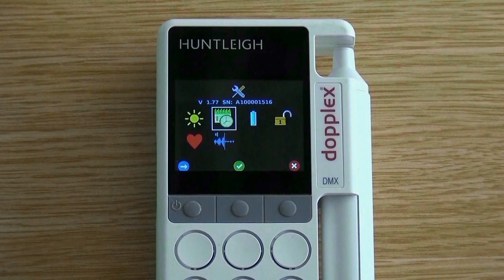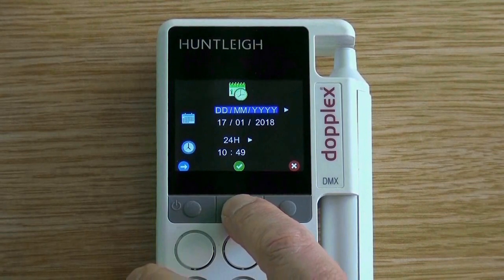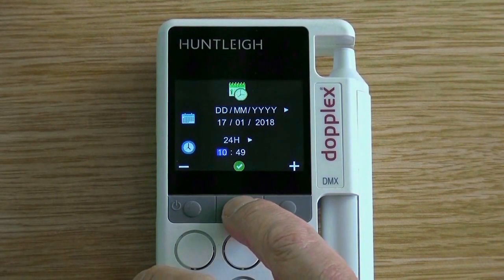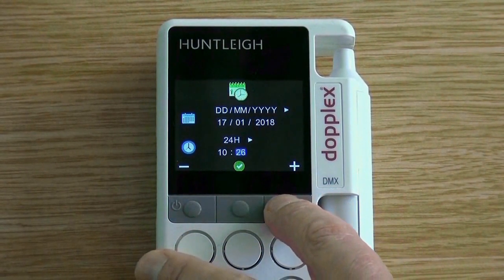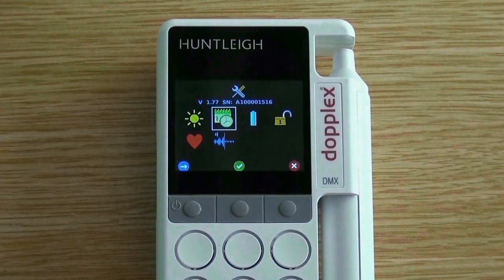To set the time and date of the unit, enter the setup screen by pressing the right hand button for three seconds. Scroll to the clock symbol and click the centre button to enter. Press the centre button to move through the time and date where correct. If the time does need changing, press either the left or right buttons to select your desired time. Press the centre button to go back to the probe, and press the left button to move through the previous screen.